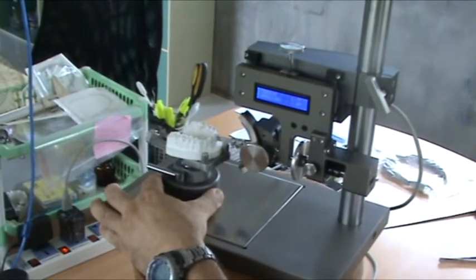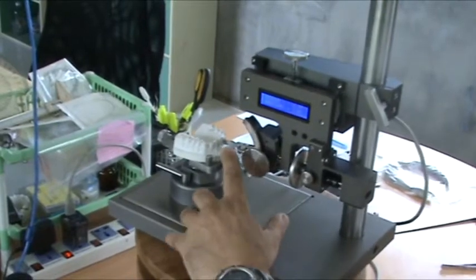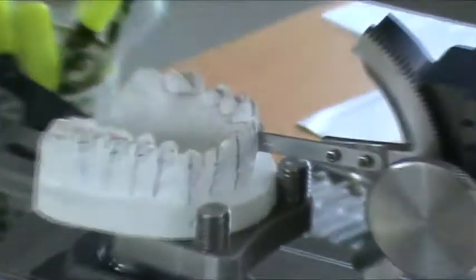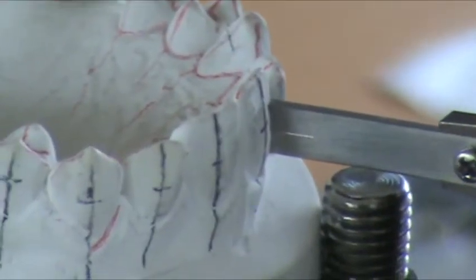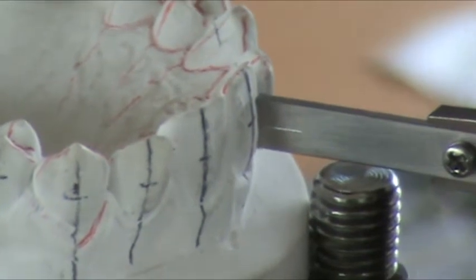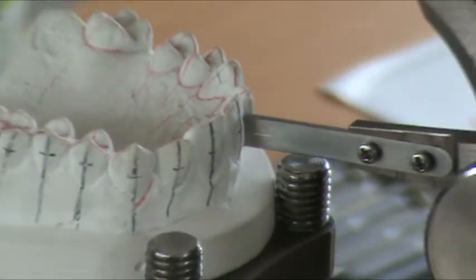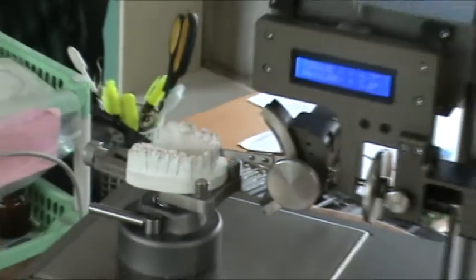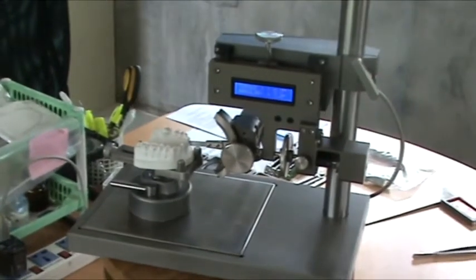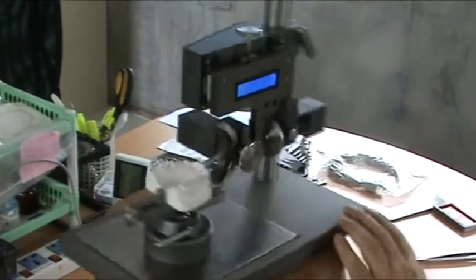The trick is also to look at the space between the blade, zoom in on the space here, between the blade and the tooth. Because if we fit the blade to the tooth, then maybe the morphology of the tooth will trick us. So we want the general inclination of the tooth. And that measures the torque, inclination. Simple as that. A tooth can be surveyed in 30 seconds.